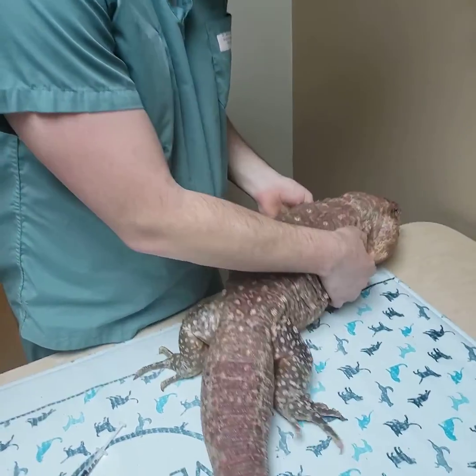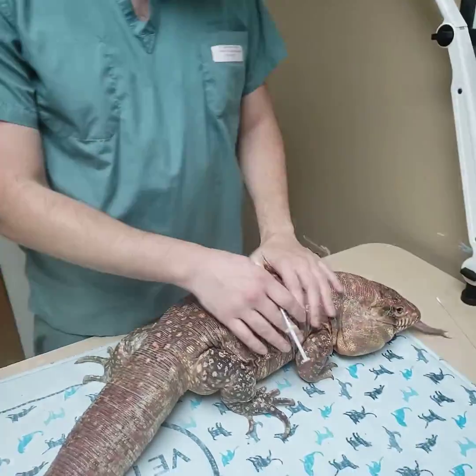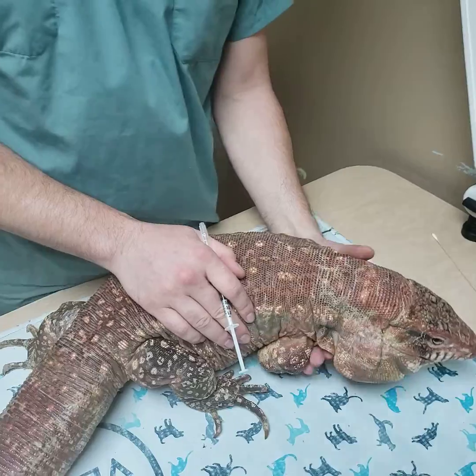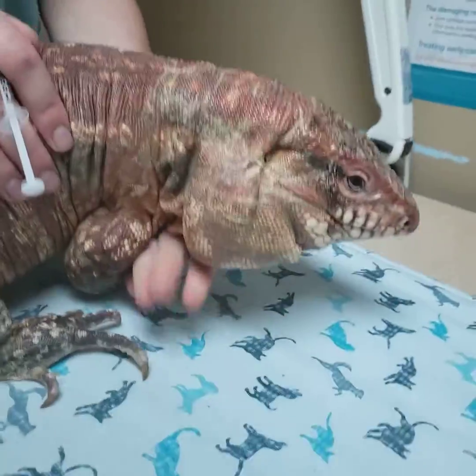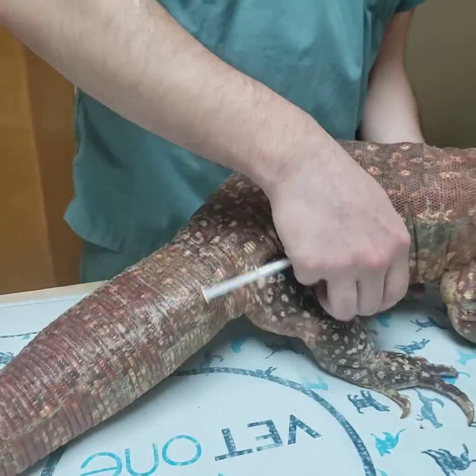So we'll have our lizard. Usually for a guy this big we don't need to do too much other than to just have him in front of us and make sure we can get a good hold on him — our hand underneath his chest.